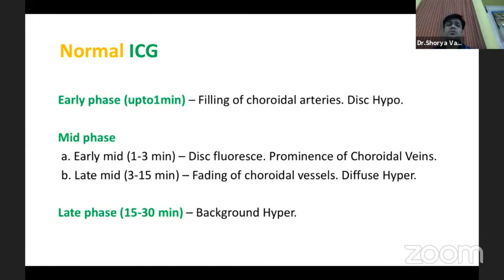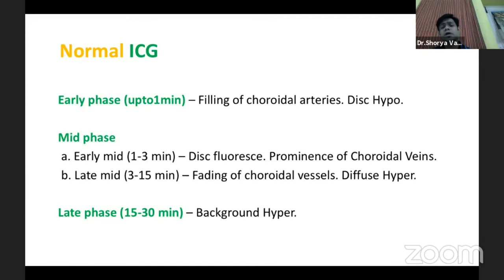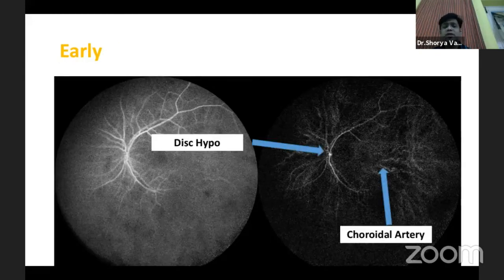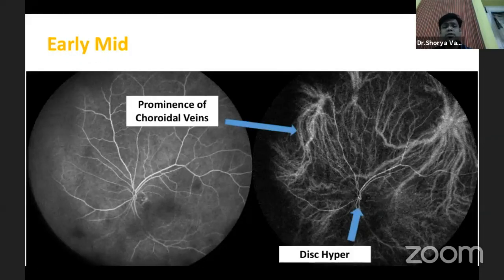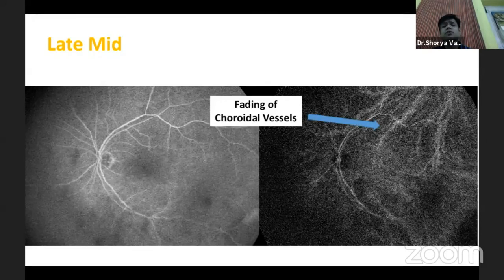Comparing normal ICG to normal FFA, it has different phases. The early phase is when filling of the choroidal arteries occurs and the disc is hypofluorescent due to the watershed zone. The mid phase is divided into early mid and late mid: in early mid, prominence of choroidal veins occurs; in late mid, fading of choroidal vessels occurs with diffuse hyperfluorescence that becomes even more prominent in the late phases. As seen in the images, the disc is hypofluorescent in the early phase, then fluoresces in the early mid phase, and choroidal vessel fading occurs in the late mid phase.